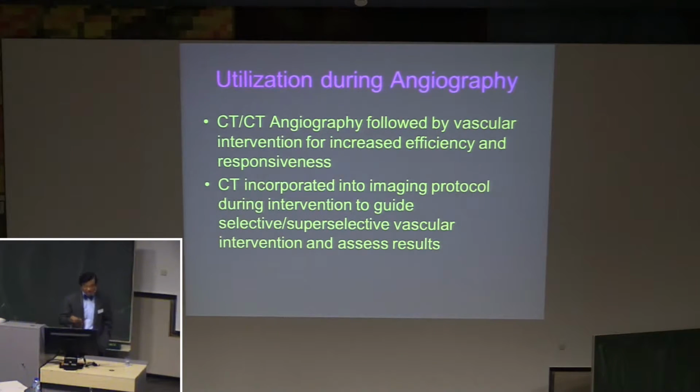The other is to have the CT incorporated in between as an imaging protocol during the intervention to guide selective or super selective vascular intervention, and then also to assess the results as you treat the patient. And for the purposes of my talk, I'm going to focus on the second utilization.